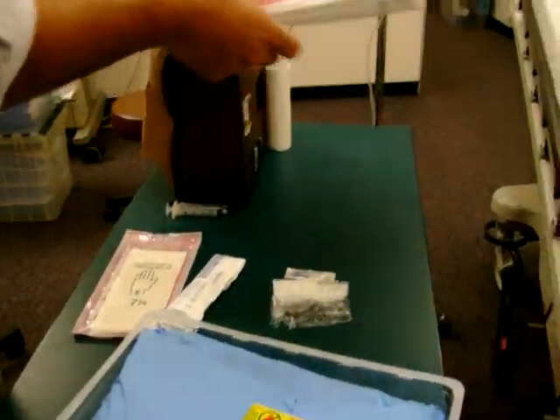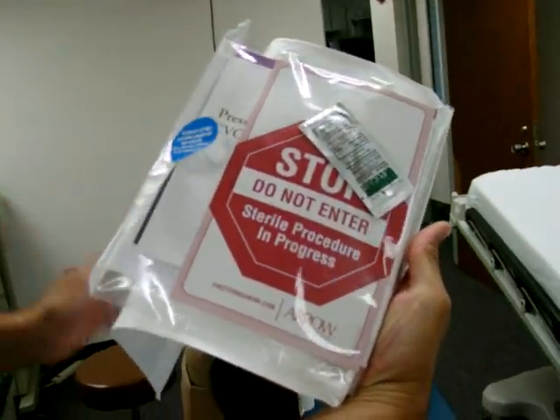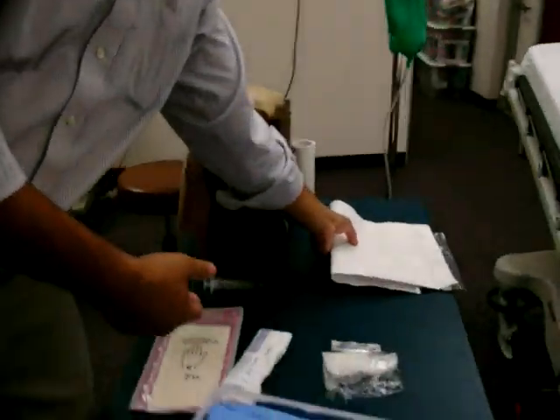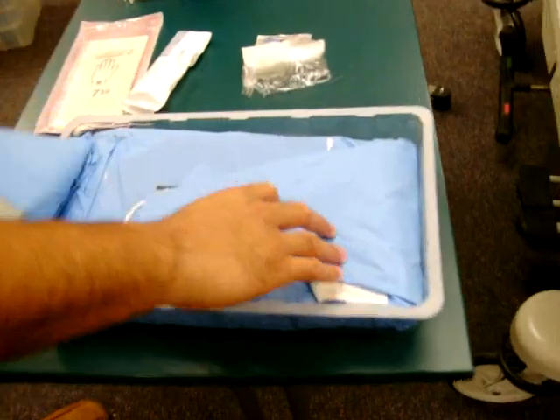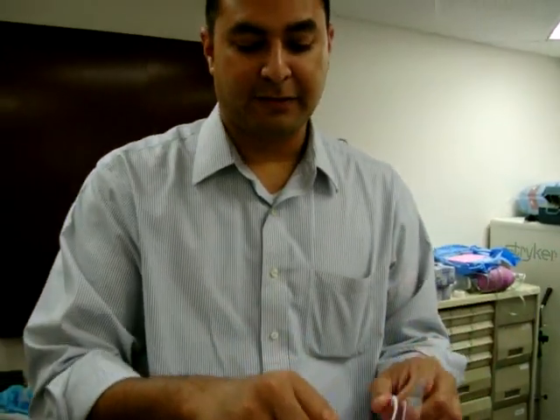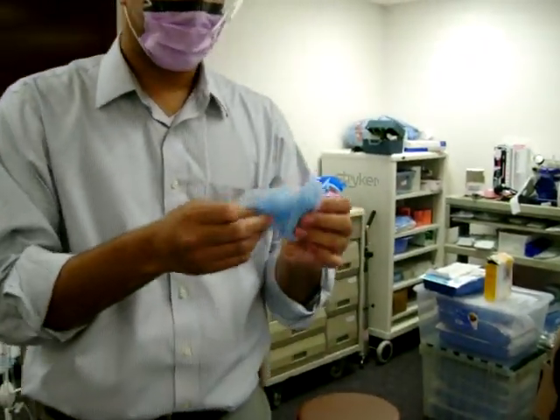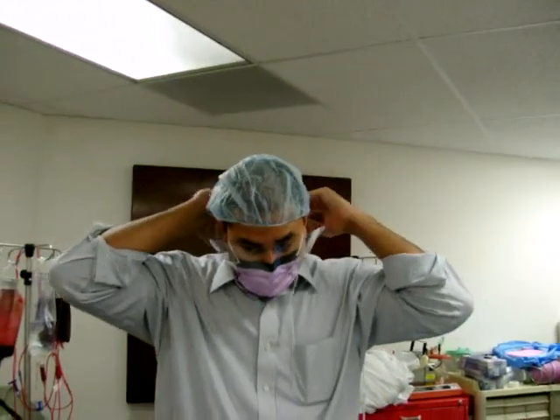Anytime you're doing a central line in the hospital, it's JCO requirements that you hang a sign on the door that says 'do not enter' because you're doing a procedure under sterile conditions. Once you have your kit open, remember you've got to take care of yourself first. You have to do all the things to make yourself safe for the procedure. Number one is protect your eyes, and you don't want anything falling on the field or coughing on it. So make sure you get your mask ready and put that on before you get sterile. Then you have a surgical cap which anybody in the surgical field will need to wear.